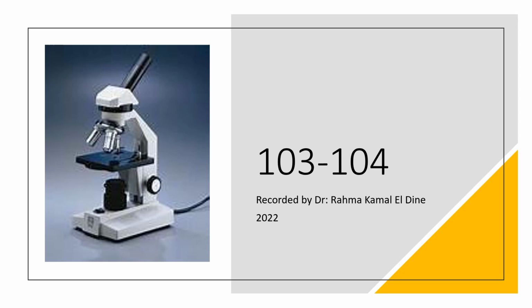Dear students, this is microscopic slide revision for modules 103 and 104.